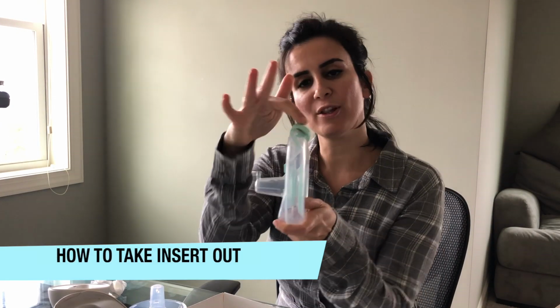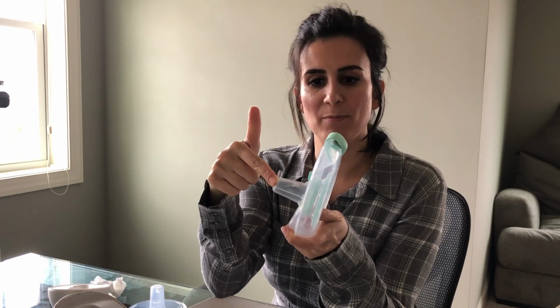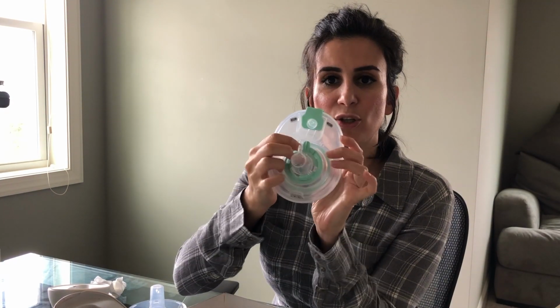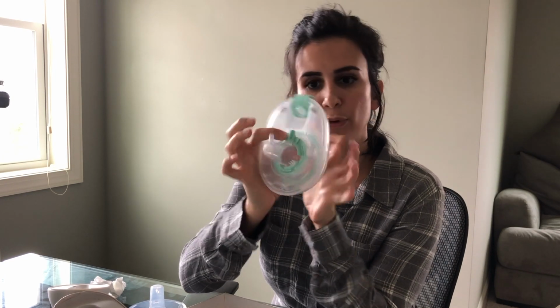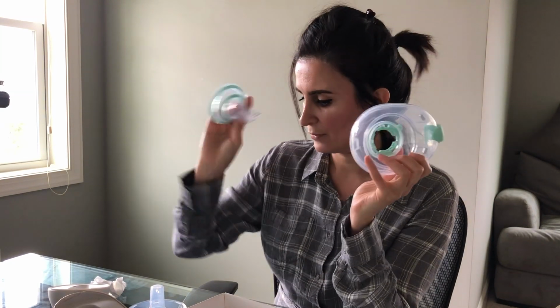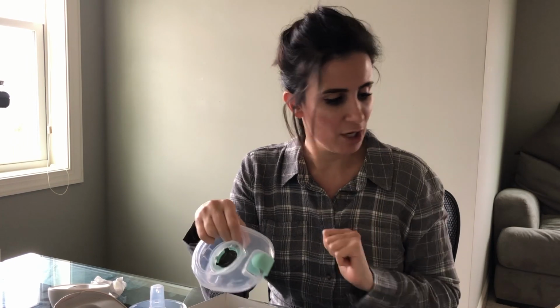Okay, so how do you put this pump together? I will show you all the little details up close first, so you know how this pump operates. Right now the insert is in lock position. There's a little lock up here, which I will show you, and you unlock, and that's how the pump insert comes out. This is the 27 millimeter. Now, most women pump with a 24 millimeter flange. That's where most women land, and that's where it comes as a separate insert.